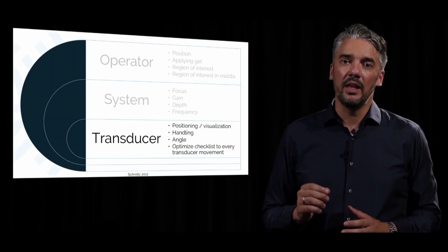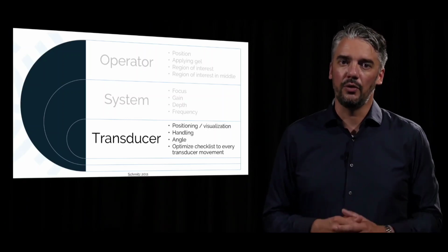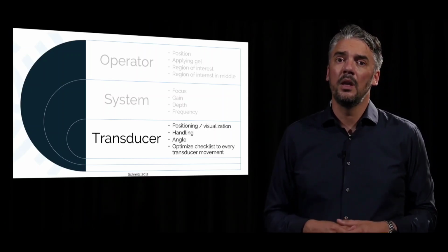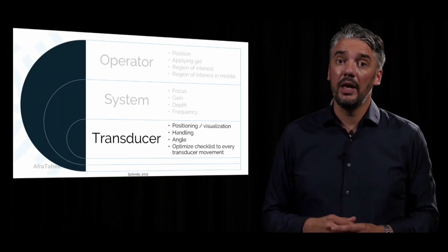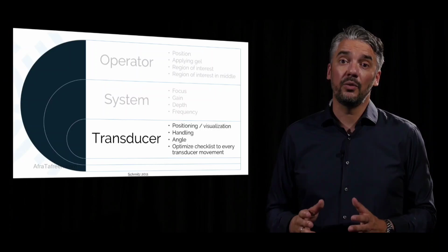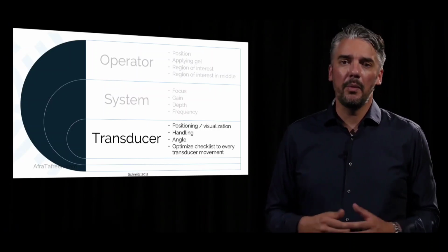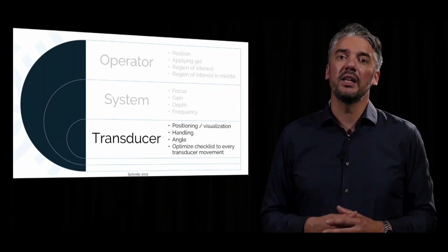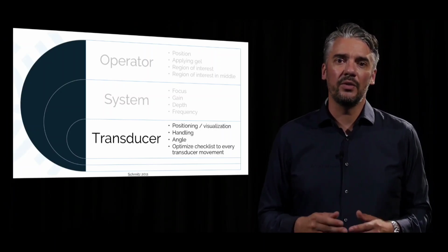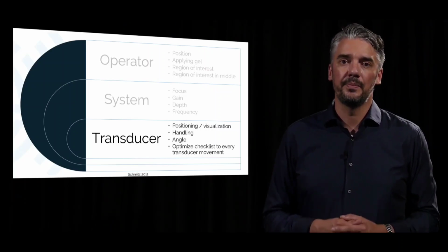There is generally less convention with respect to imaging structures transversely or in short axis. Some maintain the left side of the screen as the anatomic right, and others orientate the left of the screen as the medial aspect of the body. It is probably best to perform transverse or short axis live scanning in a position that makes sense with the orientation of the patient with respect to the screen.